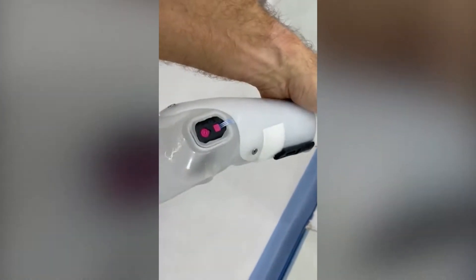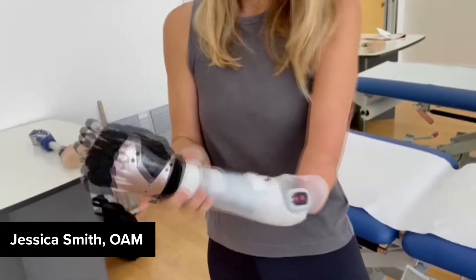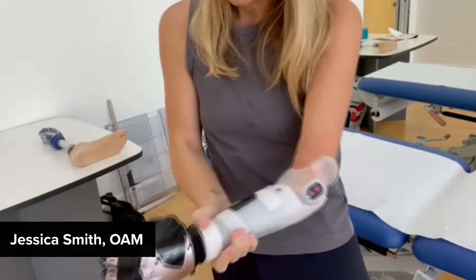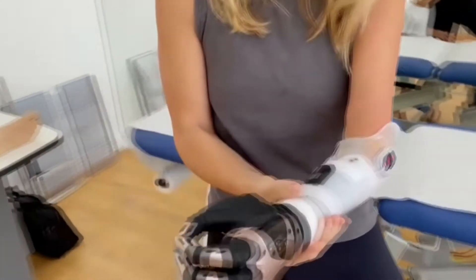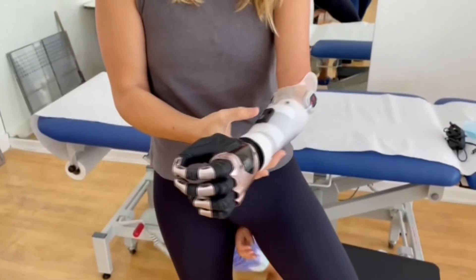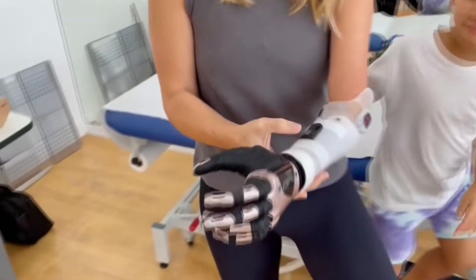The test socket is ready and we're going to discharge it today. The idea is that this will be silicone and this will be black carbon. Can you put it on again? Yeah, easy. Yeah, no worries — there we go, you're doing very well.